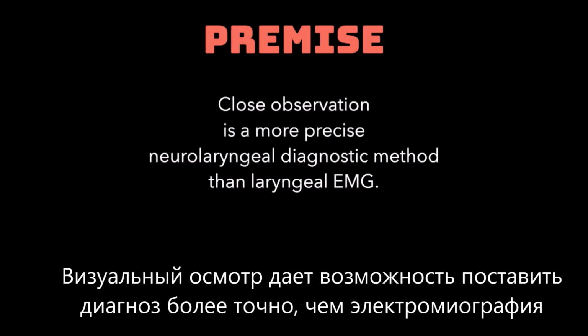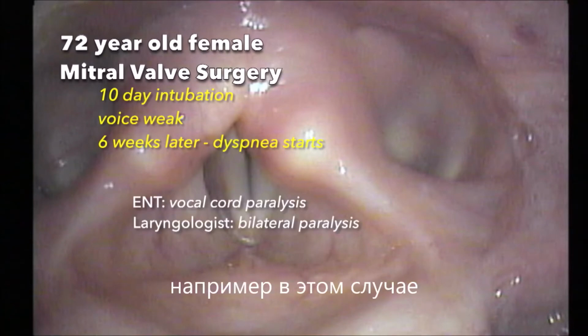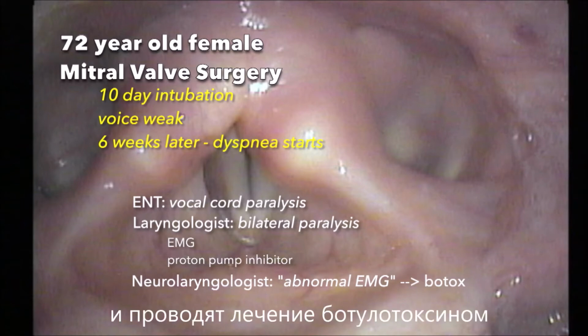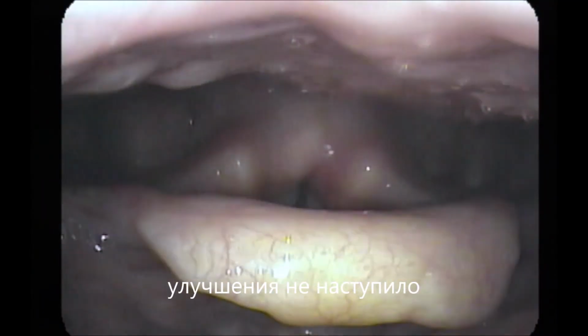A visual exam offers an even more precise exam than an EMG. Take this case where an ENT diagnosed paralysis. The laryngologist thought the same thing, but wanted to reassure himself with an EMG. And the neurolaryngologist said it was abnormal, and they gave the patient Botox. She did not get better.